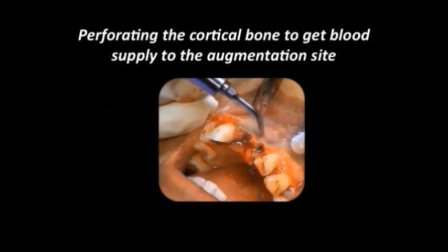So in this case, I'm trying to use the piezo machine in order just to initiate bleeding from the bone. And as you can see, I'm trying to avoid the site of the implant. You can see the grayish color of the implant shining through the bone. I try to do around it, but not on it, in order to maintain the thin bone covering the implant.